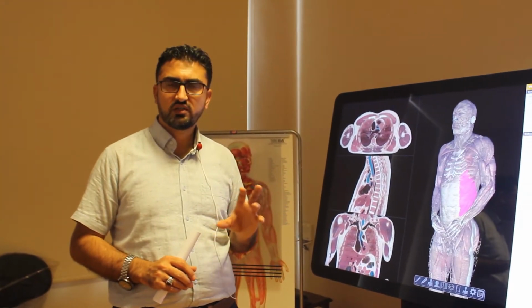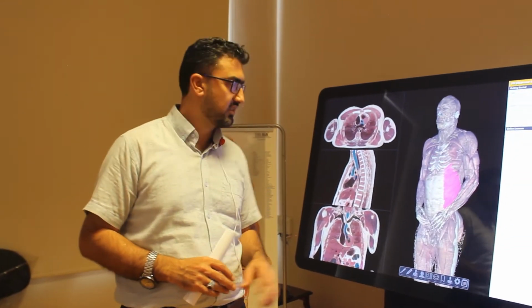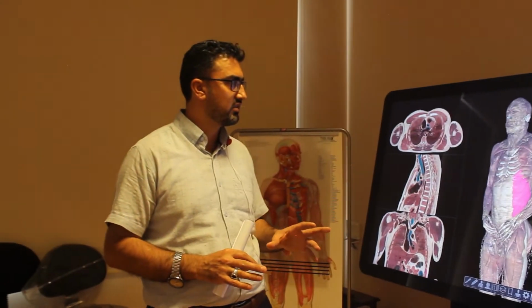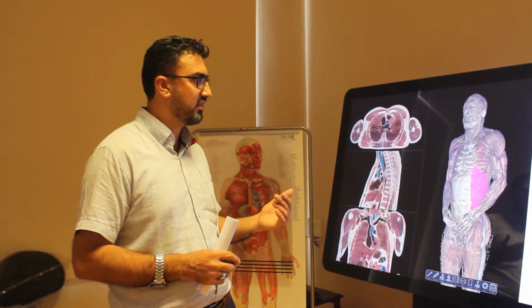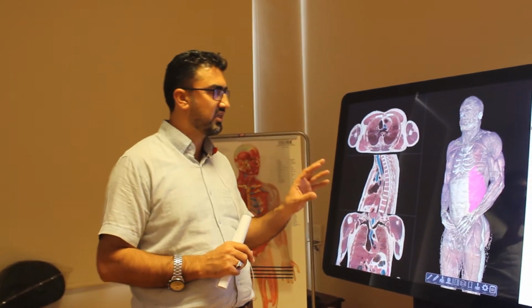As a part of the integrated system, today I will talk about the anatomy lab, and especially a special tool for studying, demonstrating and teaching anatomy sessions, practical and theoretical, which is called the Sectra table. The Sectra table, by definition, is an interactive learning and teaching device for use with real anatomy and clinical cases, to provide critical thinking in clinical training. The main idea is clinical training.